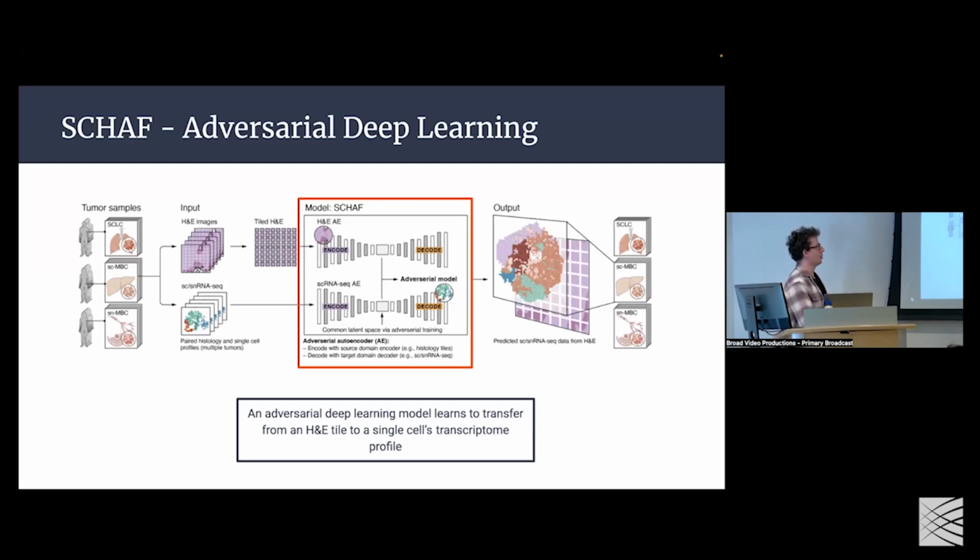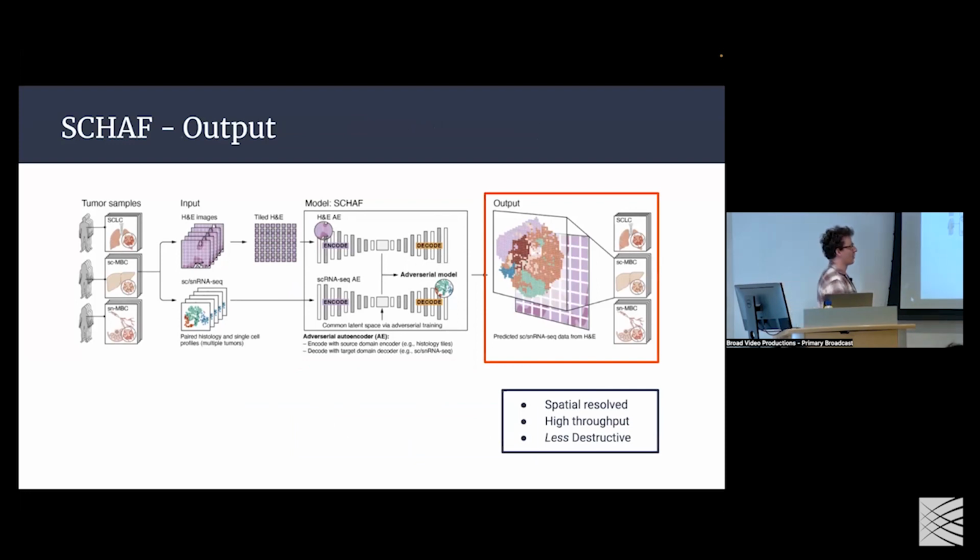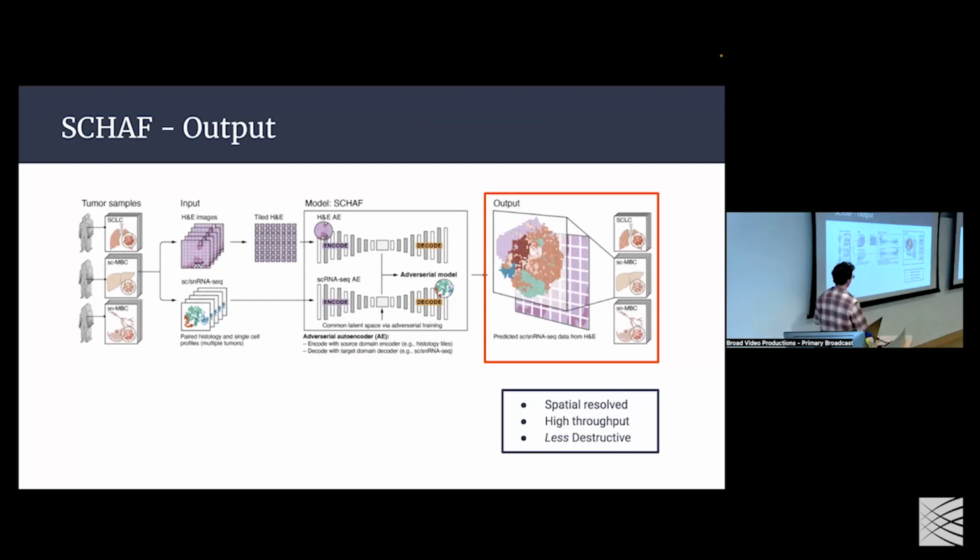Okay, no other questions. I assume everybody knows exactly what is going on. So with that being said, we talked about our output. Our output is, again, spatially resolved to an extent. You have a tile, you have the transcriptomic profile, so you know that tile corresponds to that profile. It is spatially resolved. It's nice. It's also high throughput. Each of these profiles you generate roughly 20,000 genes. And H&E is by definition destructive, but I think we can agree it is less destructive than single cell RNA sequencing. So all big wins, if you ask me, very big wins.